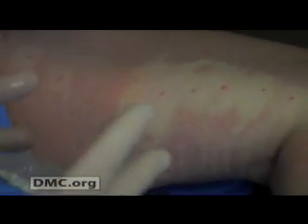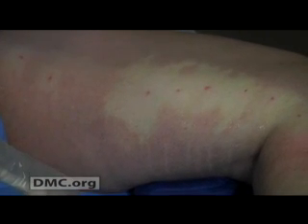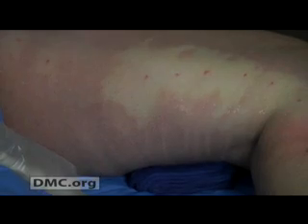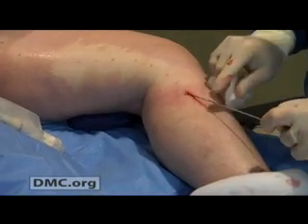The laser, right now, is causing a reaction inside the vein to result in the vein clotting off. There's damage to the inner lining of the vein itself. There's also a reaction of the heat energy with the red blood cell itself. So the end result is that the vein will contract and clot off, and it will terminate the flow within the vein. Okay, right now we're removing the laser and the sheath.